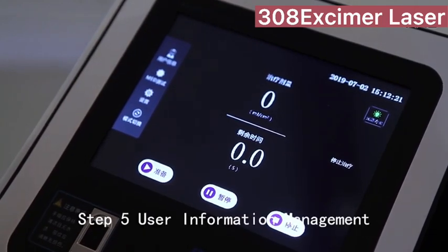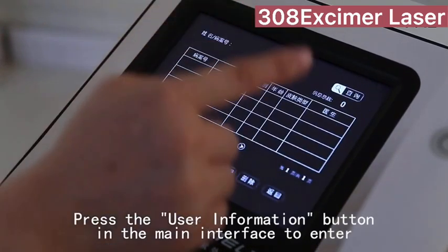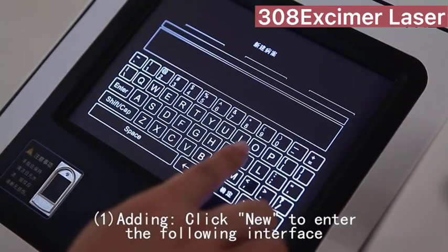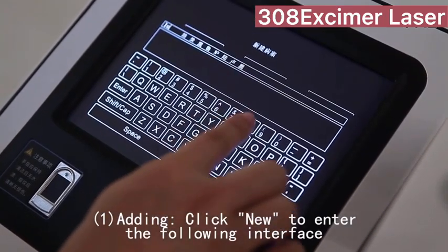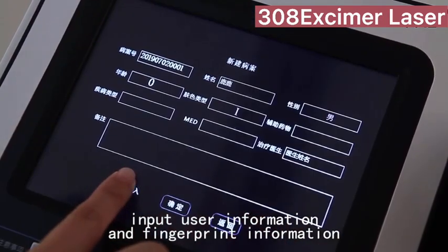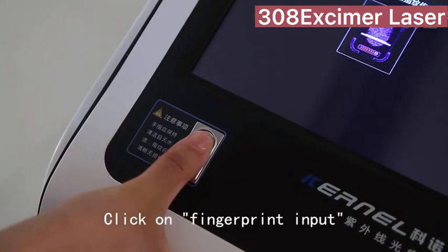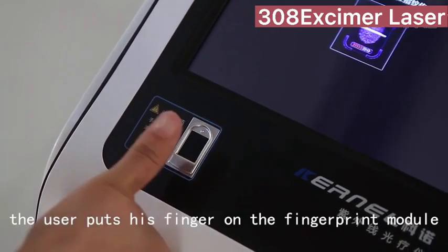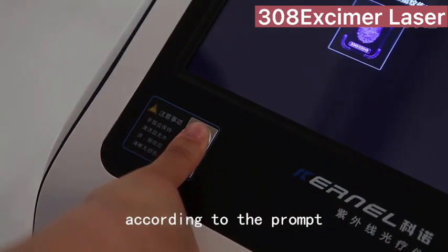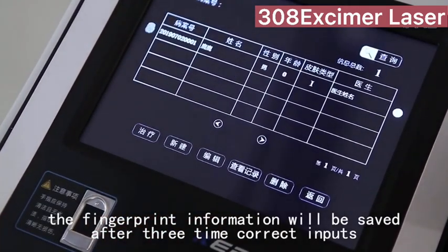Step 5: User Information Management. Press the user information button in the main interface to enter. To add a user, click to enter the interface, input user information and fingerprint information, and click OK to save. Click on fingerprint input — the user places their finger on the fingerprint module according to the prompt. Fingerprint information will be saved after three correct inputs.